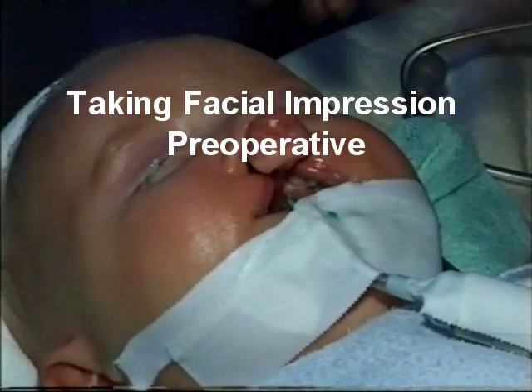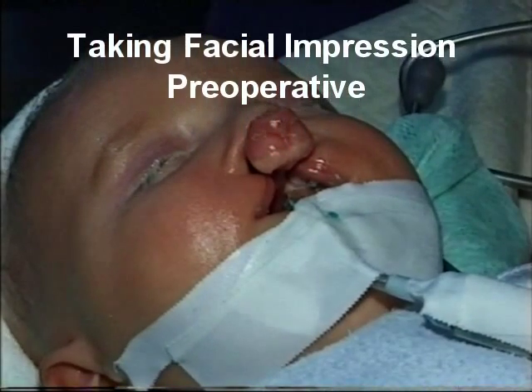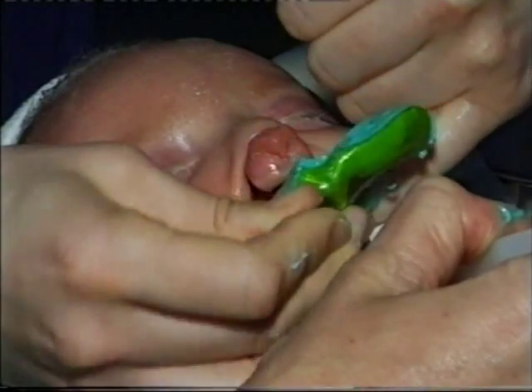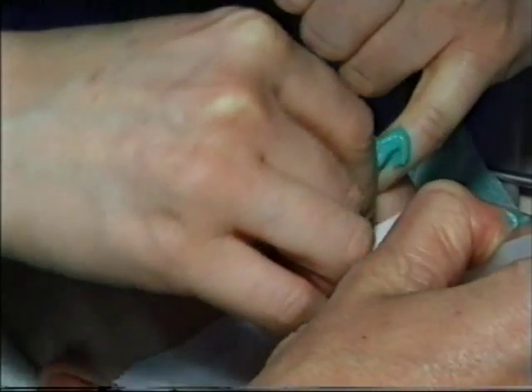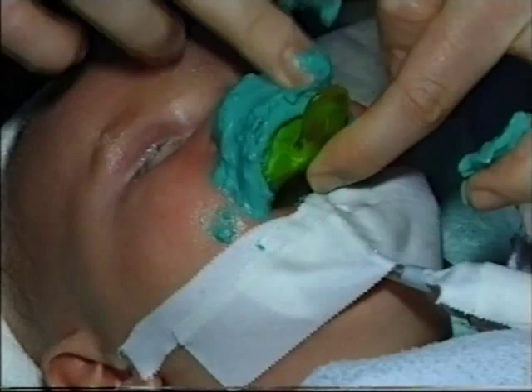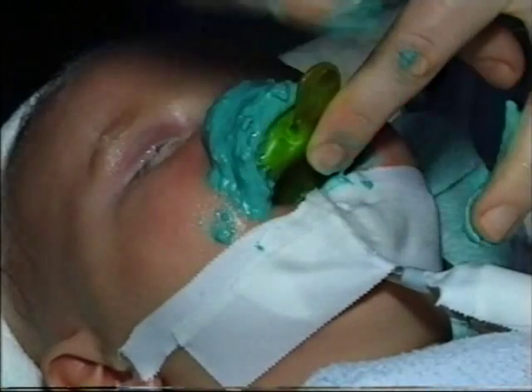The aim of taking the facial impression is for diagnostic purposes and treatment planning, because we are going to expand the two maxillary portions and at the same time retract the premaxilla. This helps measure how much we are going to expand and how much we are going to retract.